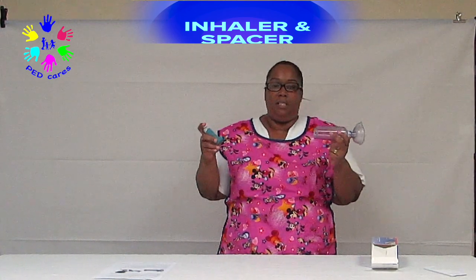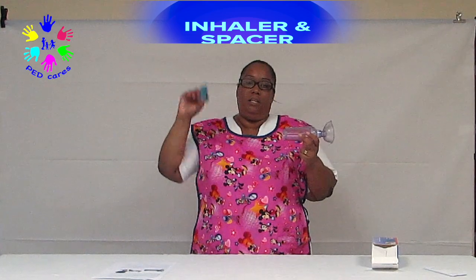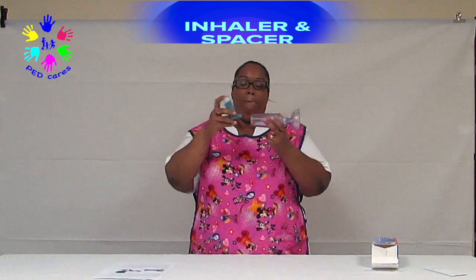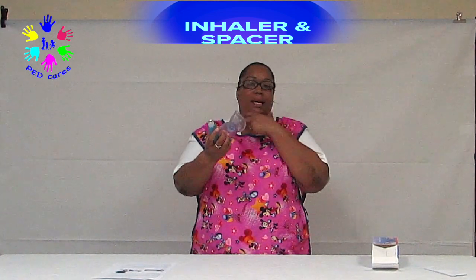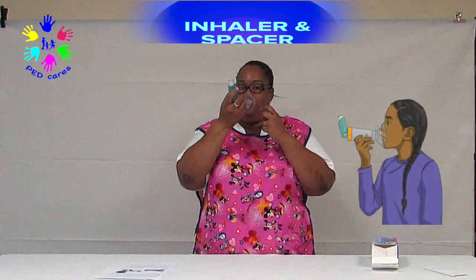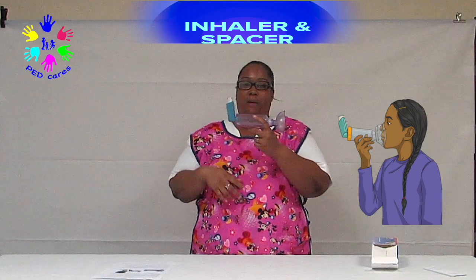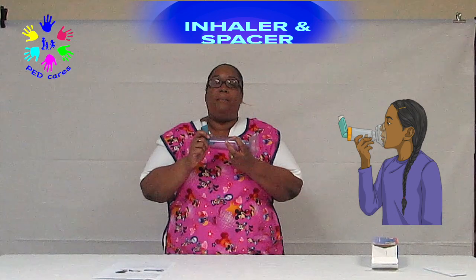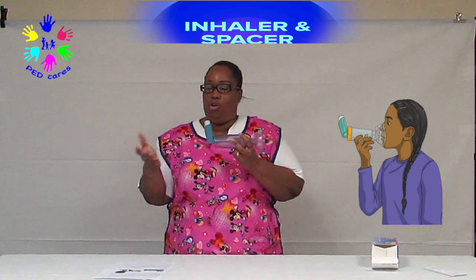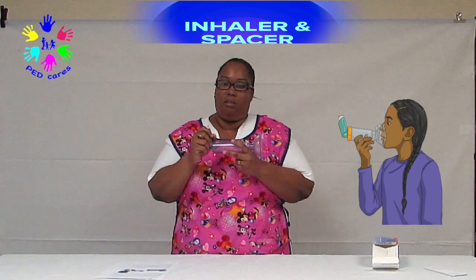So to use the inhaler and spacer device together, you need to first give the inhaler a good shake and insert it into the chamber. Using the face mask, forming a tight seal around your nose and your mouth, you would administer one puff into the chamber and breathe in and out for about 10 seconds. This step may need to be repeated depending on your advice sheet given to you by your doctor.